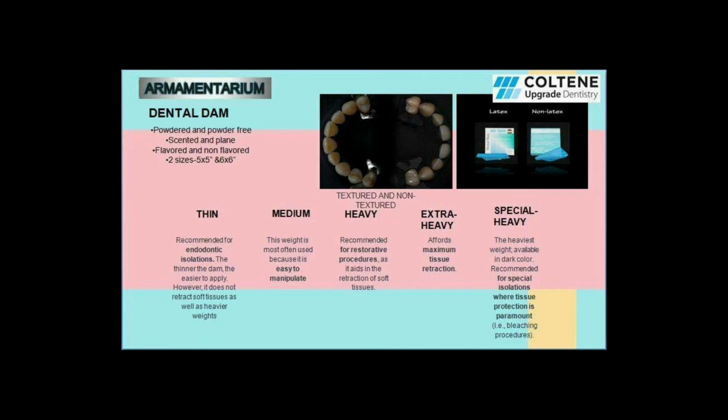Latex-free rubber dam sheets are better for people who have proven latex allergy. Then, on the basis of thickness of the rubber dam sheet, these can again be classified as thin, medium, heavy, extra heavy, and special heavy.